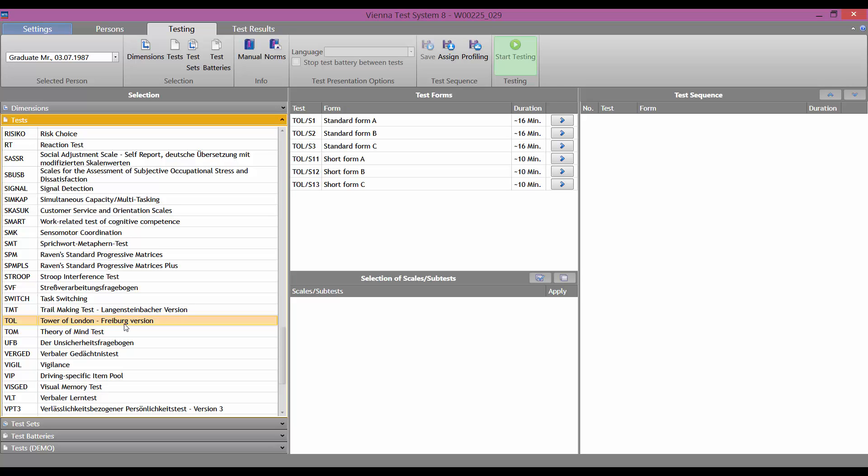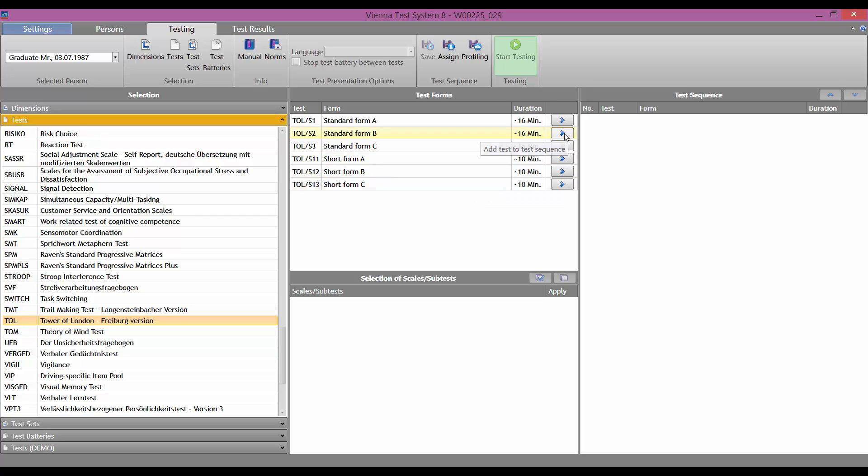It is then automatically moved into the center column, where we now select the appropriate test form. Most of the tests in the Vienna Test System have various test forms. The Tower of London has a long form and a short form, each with three different parallel forms.